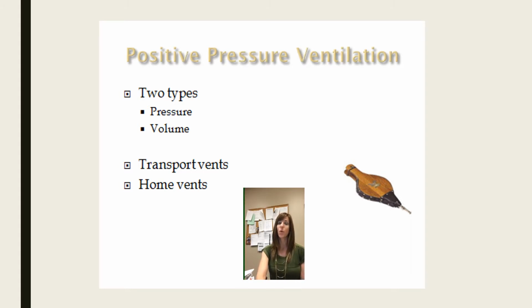What you didn't know is that you were using pressure and volume ventilation, because those are things that I was doing for you and you didn't know what buttons I was pushing. So whenever we look at positive pressure ventilation, there are some subcategories under that. The first one is pressure. What that means is that you can actually set a pressure to fill the lungs.